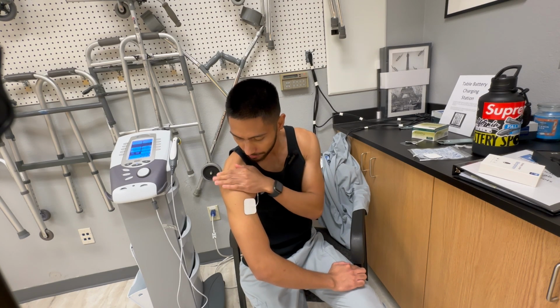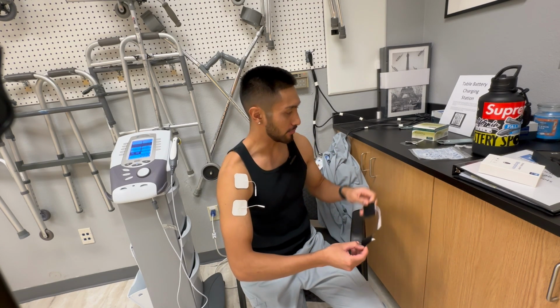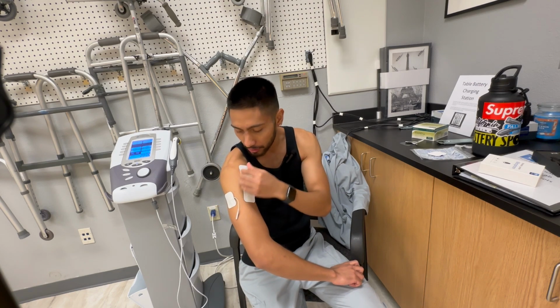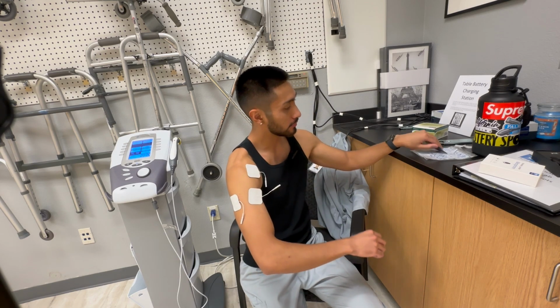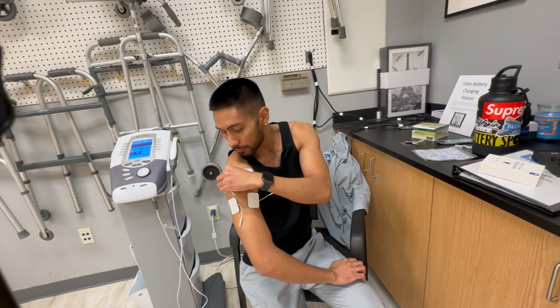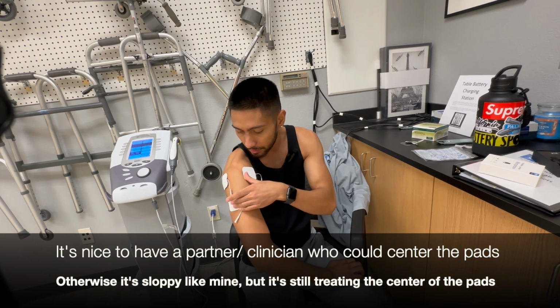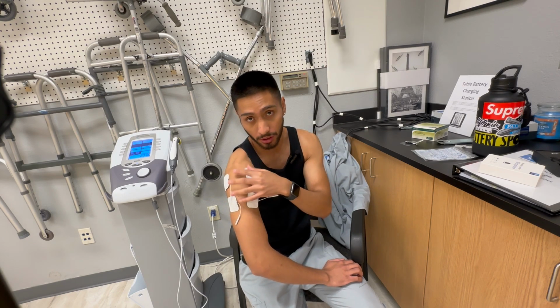Have it lined up. And having it aligned, it is important. We'll have that lined up. The wider we go, the more treatment area, but we're going to go ahead and centralize it just down to that center area of the deltoid. Perfect. And now we have all the electro pads placed down. We'll go ahead and have that be crossing in between here, where this central region is the treatment area.